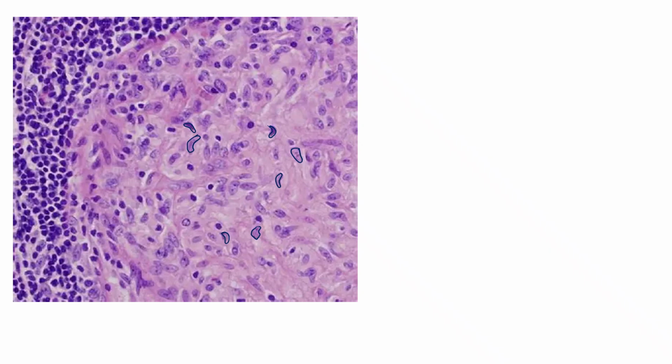If you are practicing and sitting in the market and you are asked to make a diagnosis for tuberculosis ASAP, for example, you have performed FNAC of a cervical lymph node and got pus when you aspirated. Now that pus needs to be excluded for infection and TB.